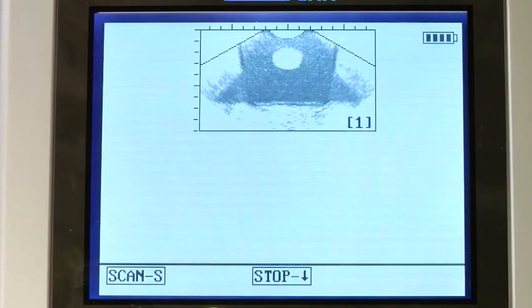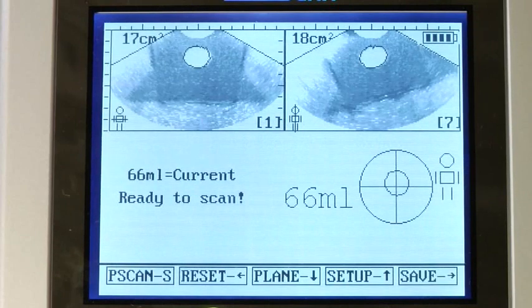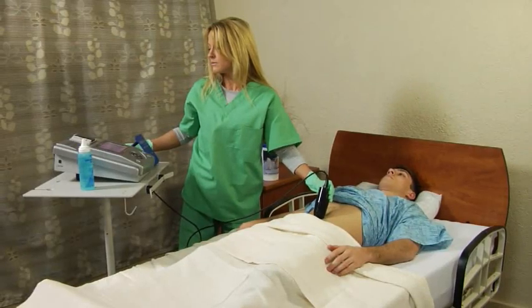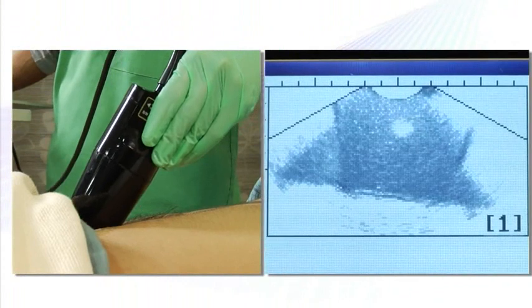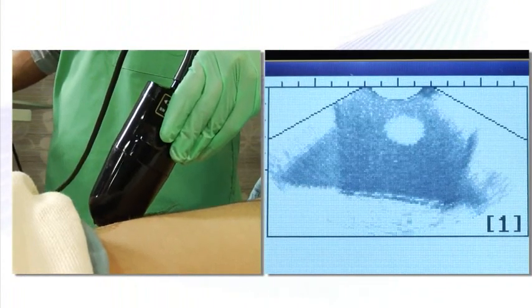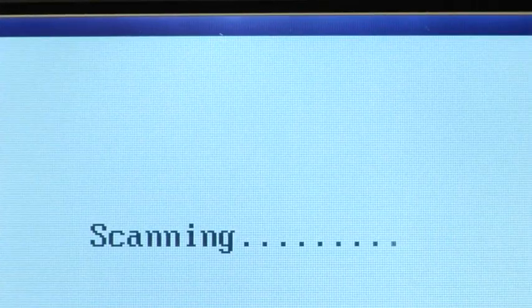An image of the bladder appears on the screen, and the device calculates the bladder volume in seconds. One of the unique features of the Biocon 500 is the pre-scan feature that lets you see a live picture of what you're about to scan. This improves accuracy by taking the guesswork out of positioning the scanner. You simply move the probe until you see the entire bladder centered on the screen, and then press scan.